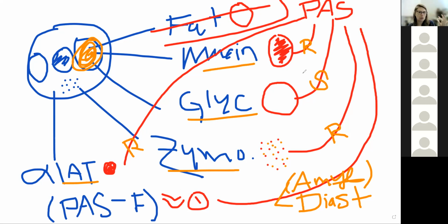You should often have that staining pattern in a squamous epithelium. So those vacuoles you can confirm are glycogen if they digest out. When you're dealing with an adenocarcinoma or a salivary gland type neoplasm or a lung type neoplasm, you'll be able to see the mucin retained. Again, if you're dealing with a salivary type neoplasm or a pancreatic type neoplasm, you'll be able to see the zymogen granules being retained, etc. All right, does that help?